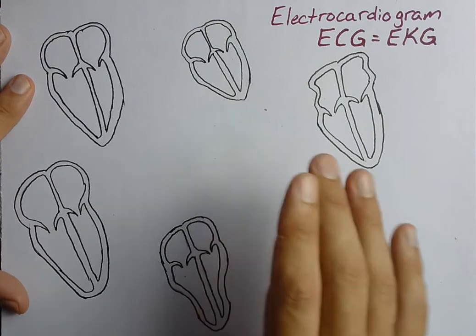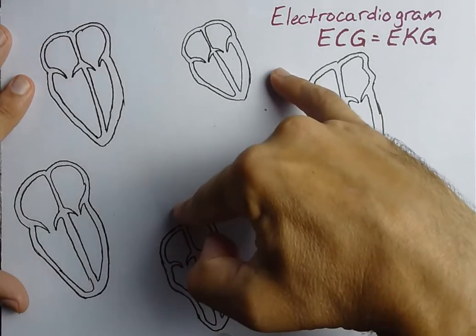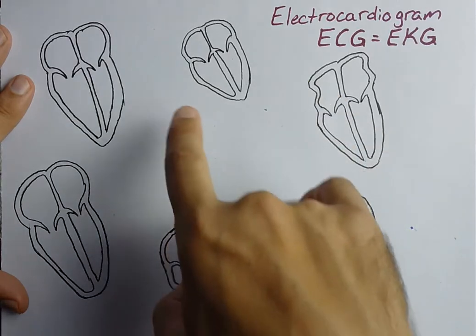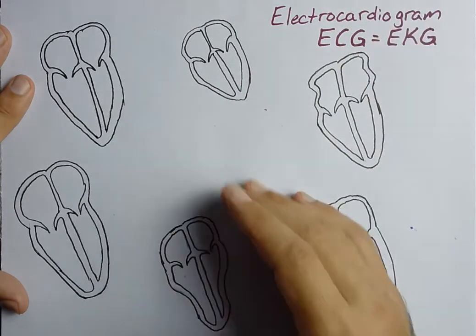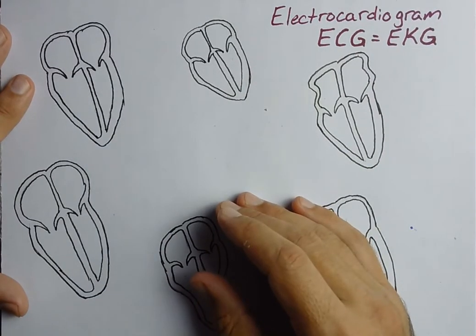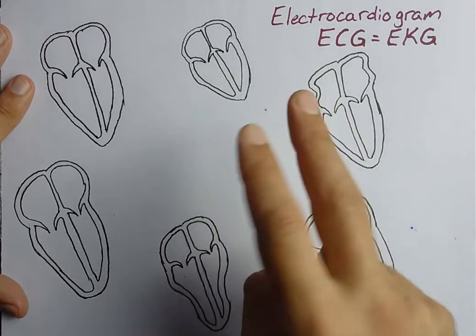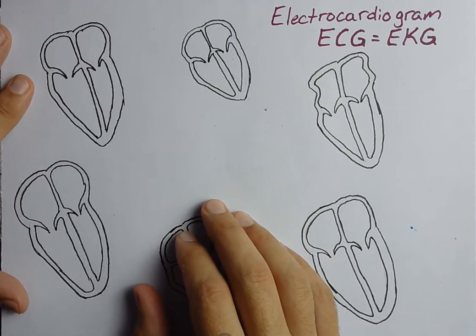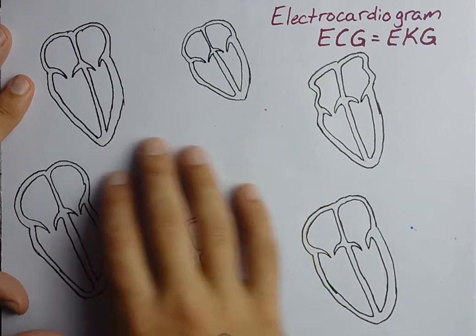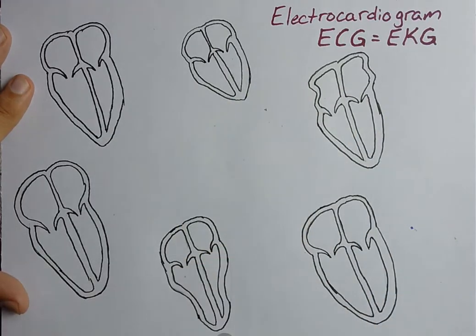What we do now is take two electrodes. Doesn't matter which two, whether it's the wrist to the wrist to the ankle, or to another one of the electrodes that you're measuring from. And you're comparing the voltage between those two electrodes. That's what an EKG is. That's going to make a little more sense when we draw out an EKG, and I left the space open here in the middle for us to do just that.